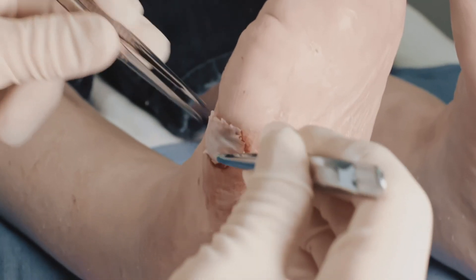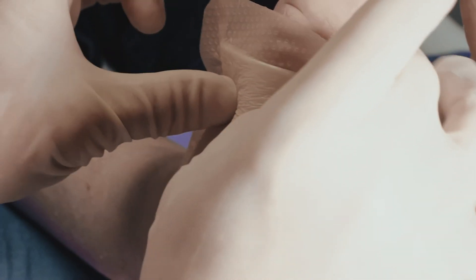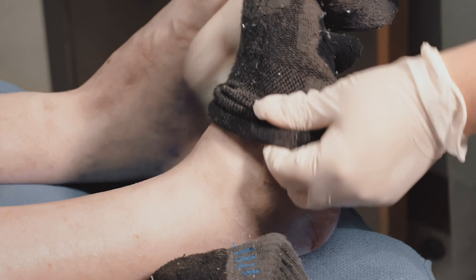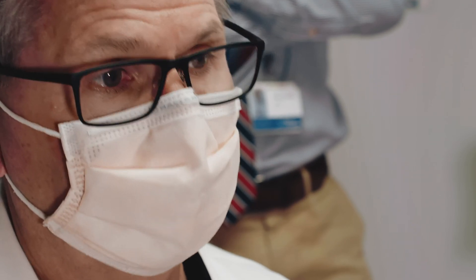It's very simple and straightforward — the ease and speed of application, it's safe, and early studies do show that it improves wound healing. Getting these wounds closed faster gets people back to a more enjoyable, active lifestyle. I think it's a wonderful device to improve healing in our patients.